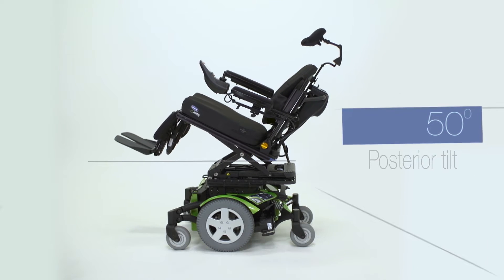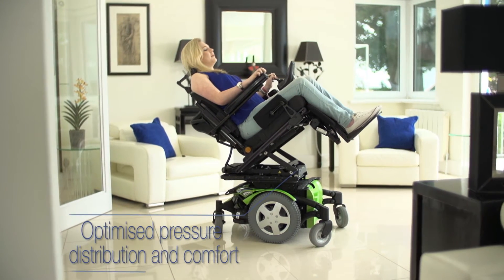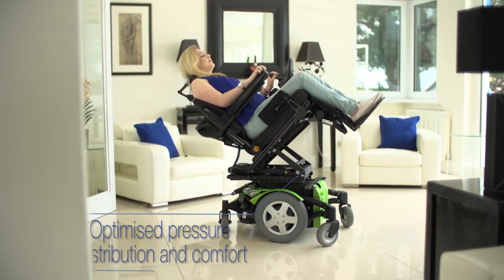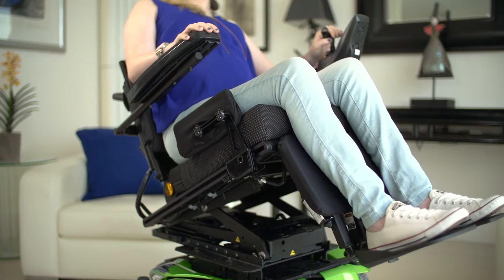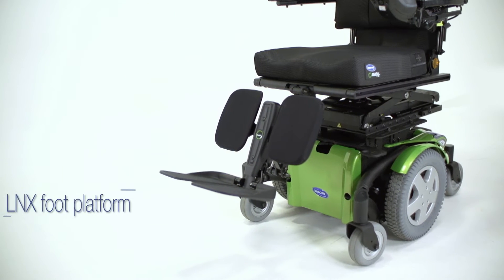The Ultra Lomax features 50 degrees of posterior tilt to allow clients to find their own individual position for pressure redistribution, function and comfort, reducing interface pressure in areas prone to pressure ulcers by double compared with traditional seating systems.